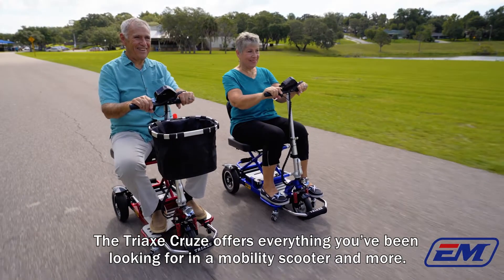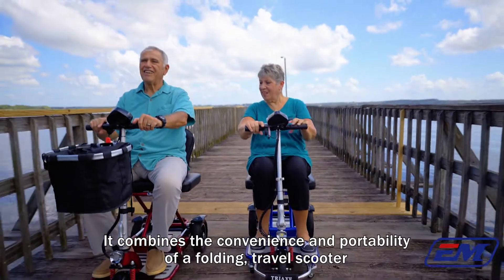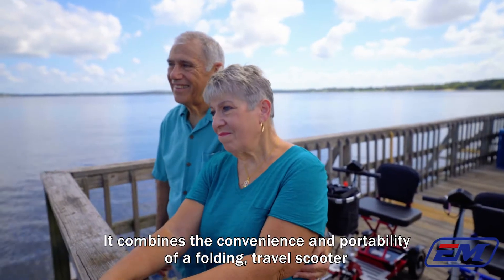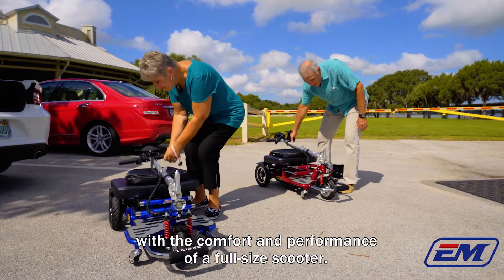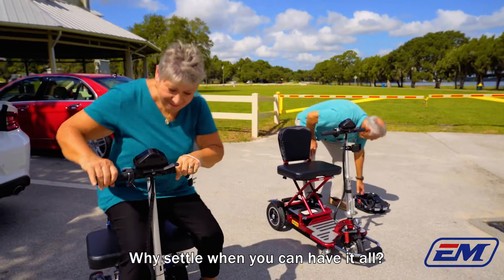The Triaxe Cruze offers everything you've been looking for in a mobility scooter and more. It combines the convenience and portability of a folding travel scooter with the comfort and performance of a full-size scooter. Why settle when you can have it all?